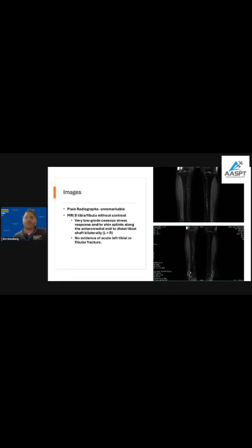along the continuum, because like the T2 images, you're going to see the fluid and water come up really bright. But what's different is that it will also suppress a little bit of the fat content to allow a little bit more contrast in the bone.